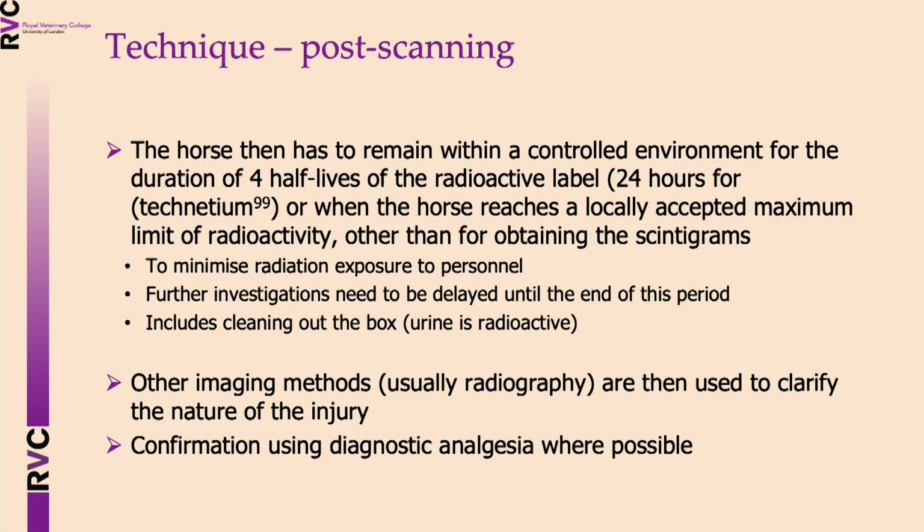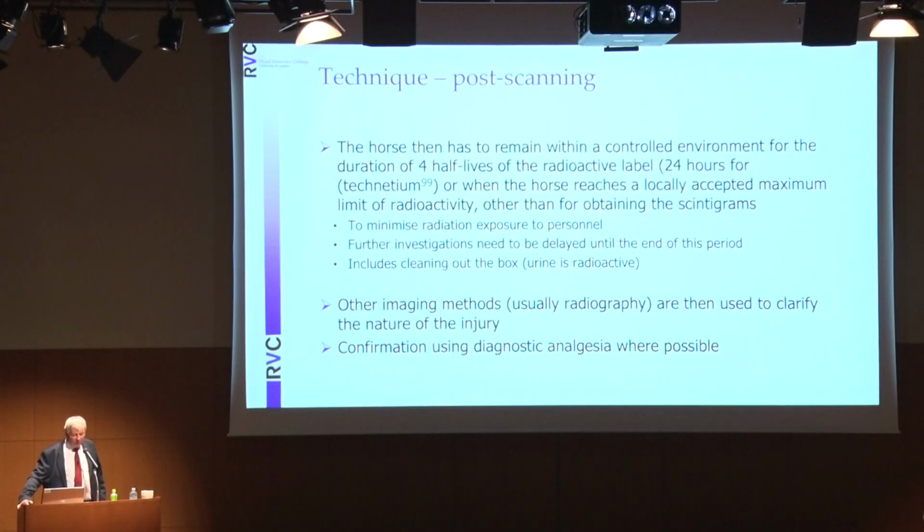This is to minimize radiation exposure to the personnel and also includes avoiding cleaning out the box because the urine is radioactive.